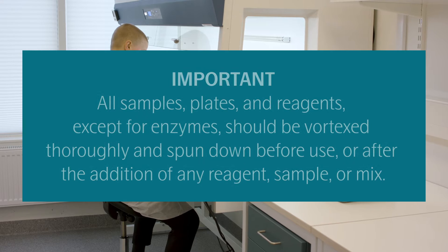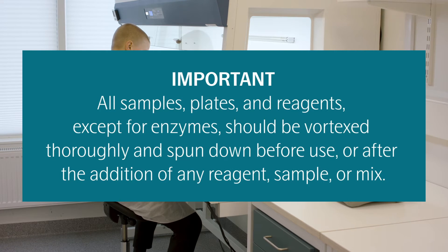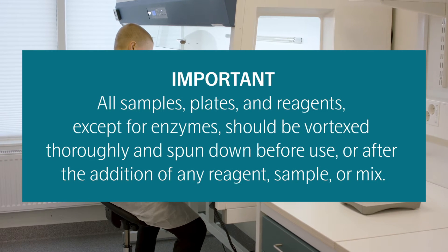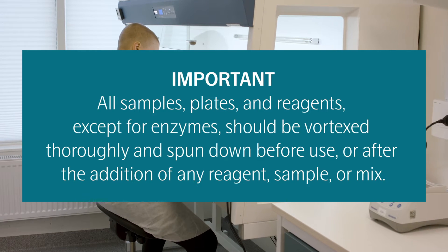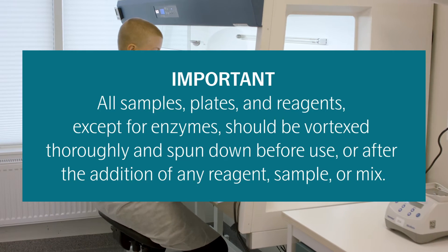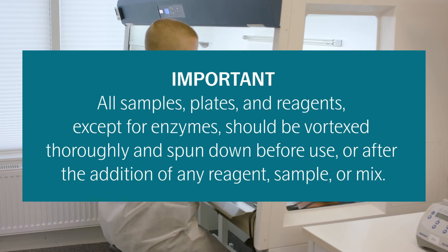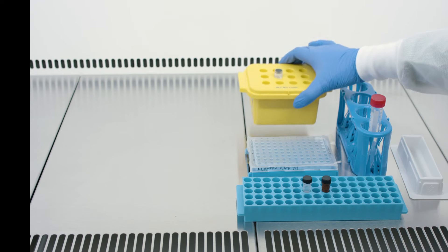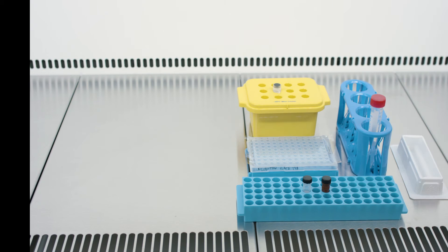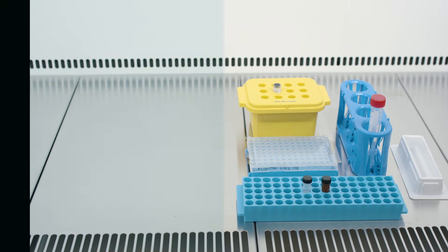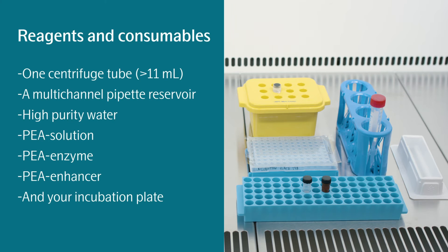As with day one, it is important that all samples, plates, and reagents, except for enzymes, are vortexed thoroughly and spun down before use, or after the addition of any reagent, sample, or mix. Prepare your lab space with the labware and consumables needed for this step. For the extension and amplification reaction, you will need the following labware and reagents.